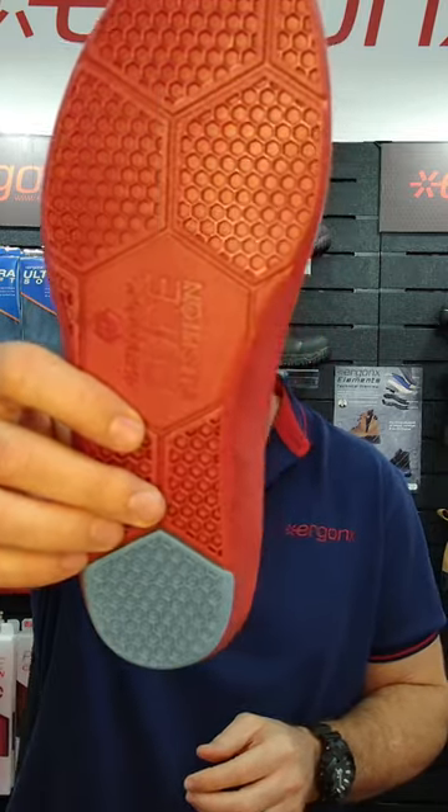When you need more cushioning in your shoes and you can't tolerate an arch support, one of the products we use in the podiatry clinic is the Ergonix Pure Cushion.